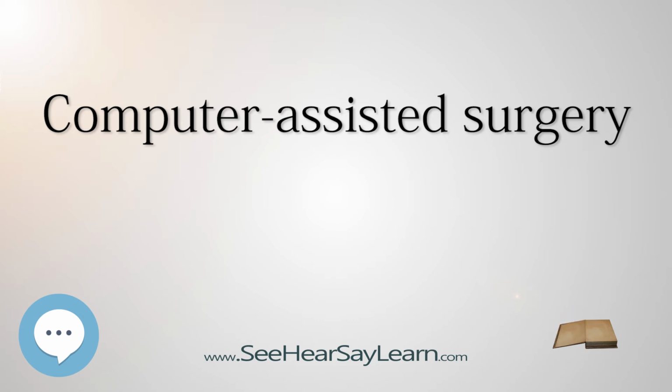After that, the splint can be removed. With the aid of a registration template, the abutments can be attached and connected to the implants at the defined position. No fewer than a pair of abutments should be connected simultaneously to avoid any discrepancy. An important advantage of this technique is the parallel positioning of the abutments. A radiological control is necessary to verify the correct placement and connection of implant and abutment.